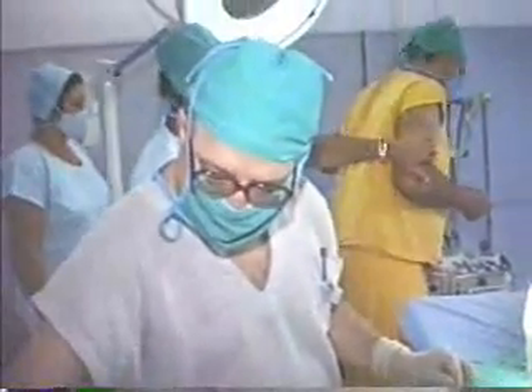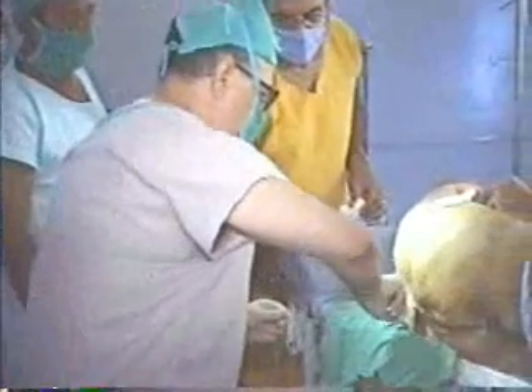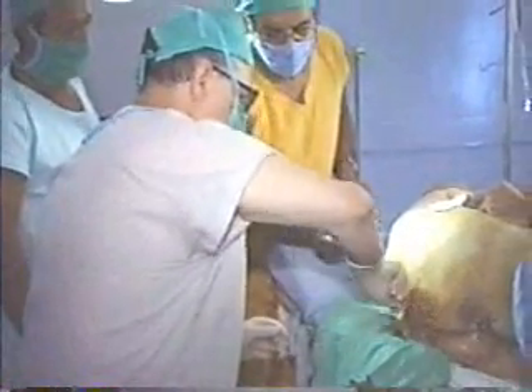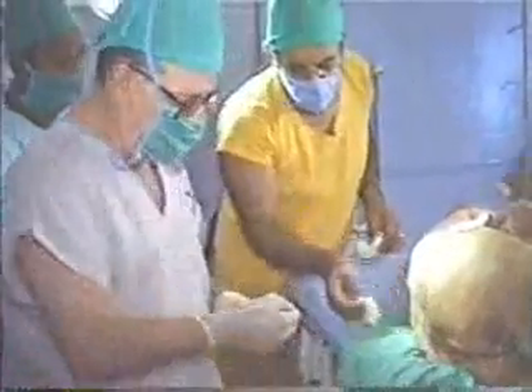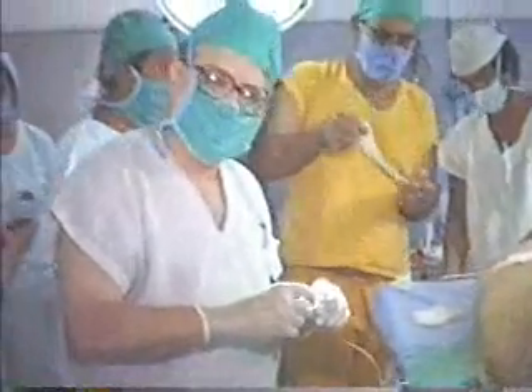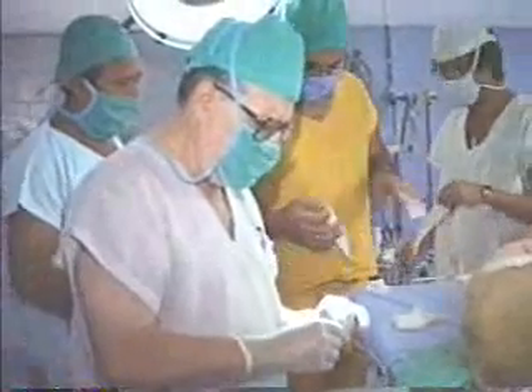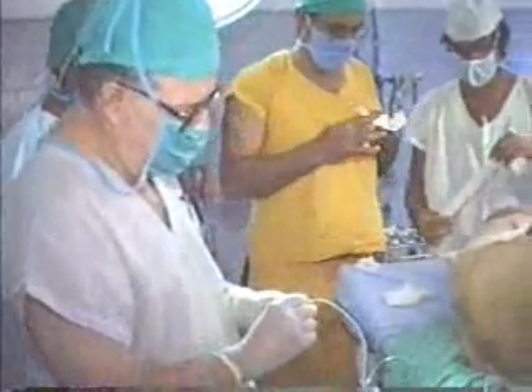Now we have a catheter in — that's half of our problems solved. We are going to fix it. For elderly patients, this is a very nice technique because they don't have headaches. You can manage them very easily.